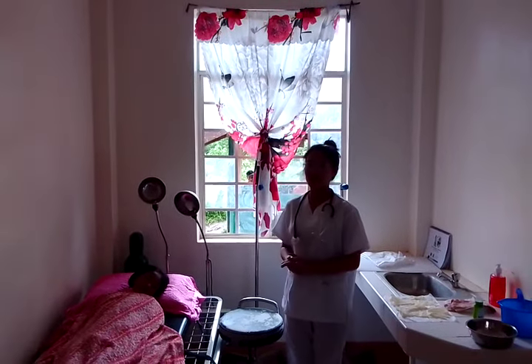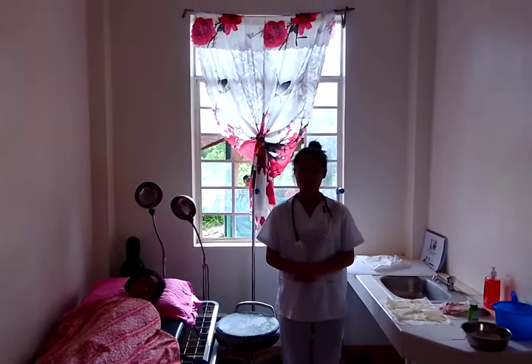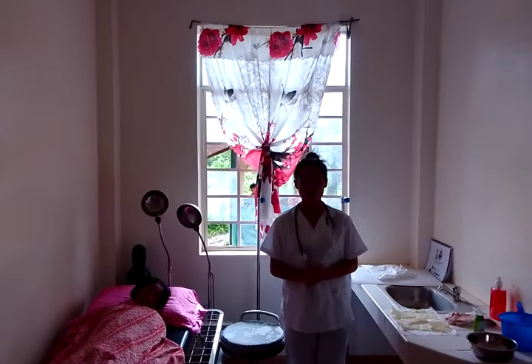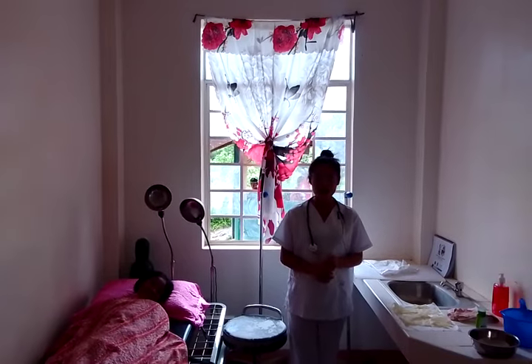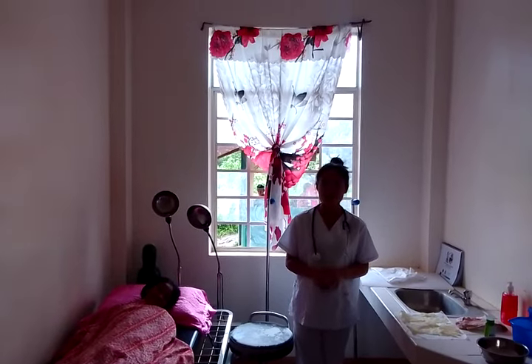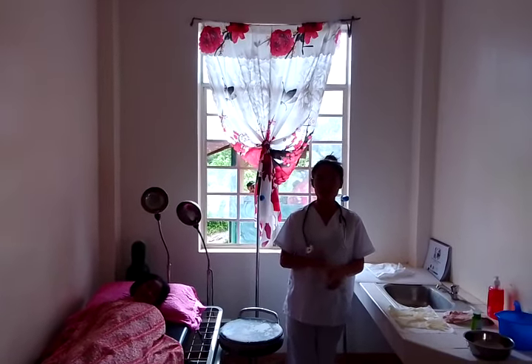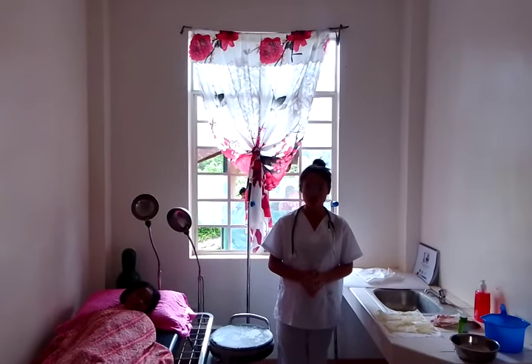Good day everyone! Today we are going to provide catheter care for female. So what is catheter care for female? Female catheters are small sterile tubes that you insert through your urethra to drain urine from the bladder.